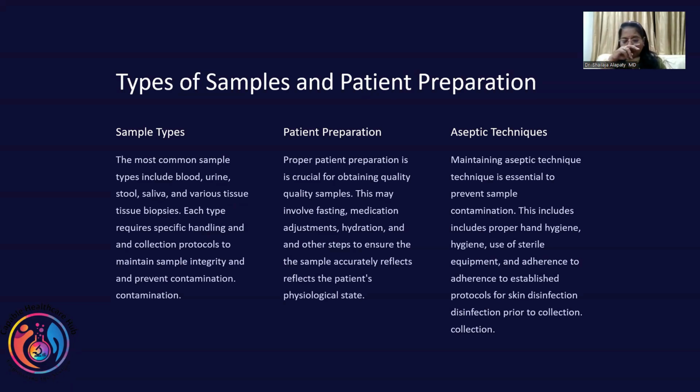And we are going on assuming, where is this coming from? Imagine if he's on the ventilator, we think, okay, it's VAP, it's a central line, it's a catheter. No, actually, he didn't have anything. And if you see, the WBC count is not increased. So that is about adherence to protocol and ensuring that skin disinfection is mandatory.